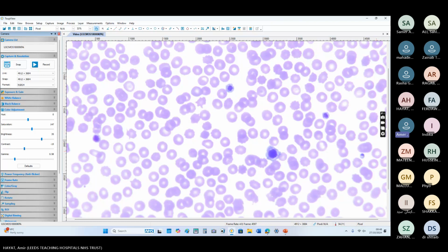We discussed that case previously in the last Part 1 session. Hopefully you will remember something. If not, then full blood count you have already. Blood film is the second one. Platelet volume is the third category.